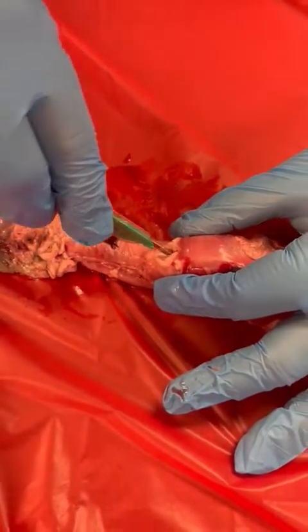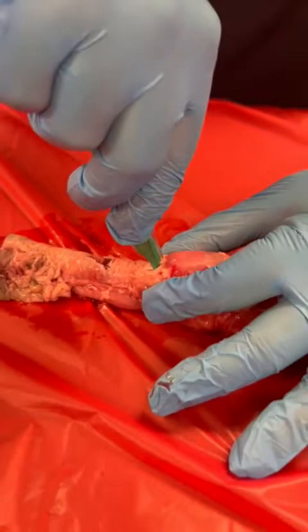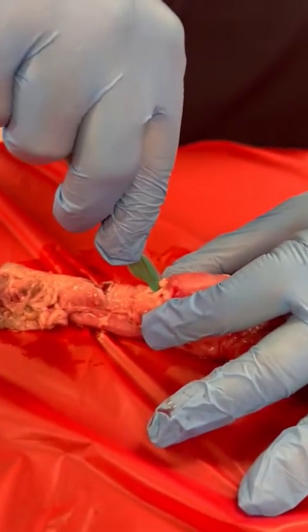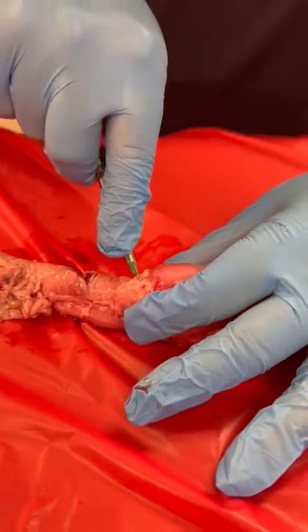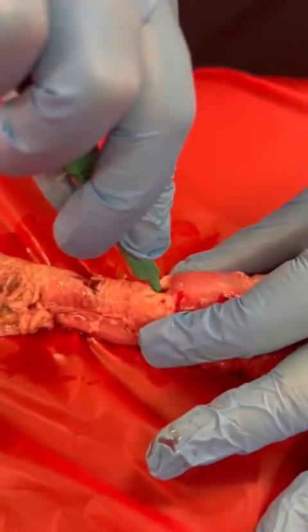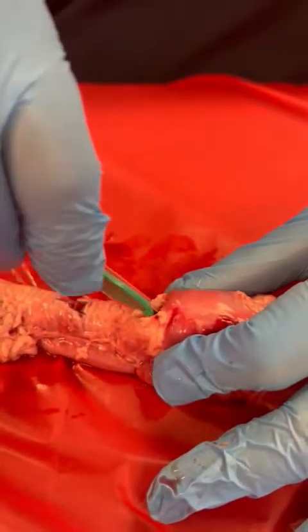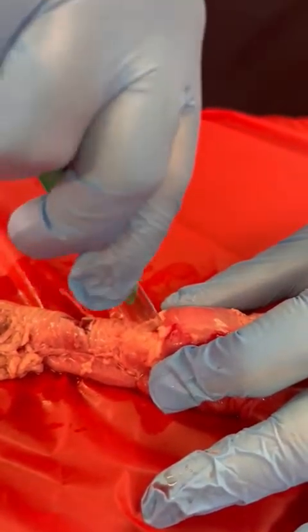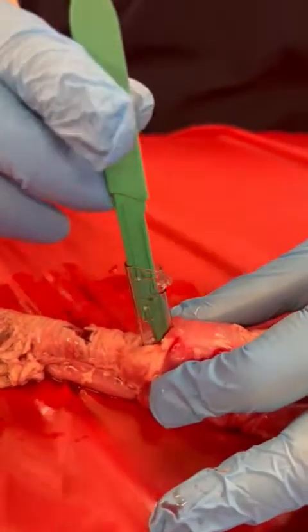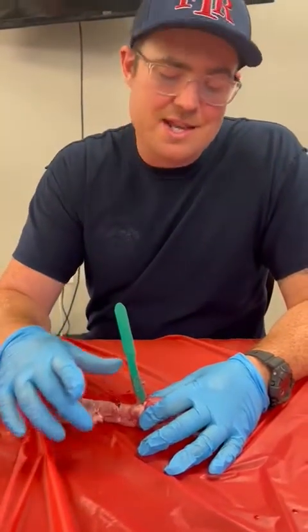What I'm going to do is provide a plunge cut — you provide a little bit of pressure. Once I'm in, I'm now inside the trachea. It is my job to make that hole a little bit bigger so I can fit my tube. Please be careful and don't cut your fingers. One thing that a lot of providers need to know is do not lose this hole. If you lose that hole, there's a chance that you are not going to find it again, depending on the size of the patient's neck.